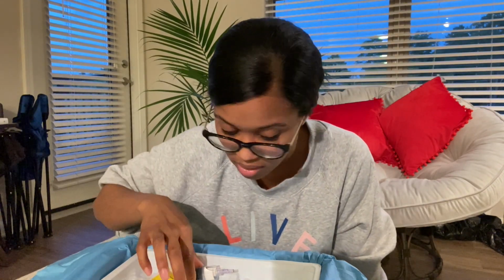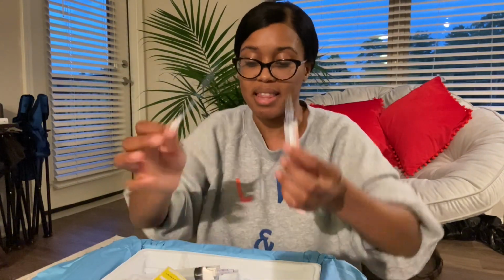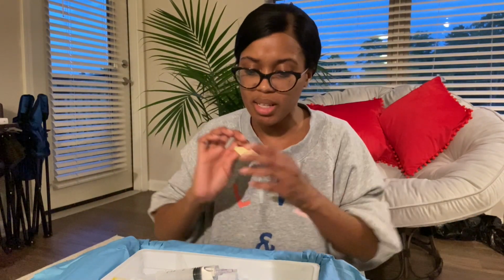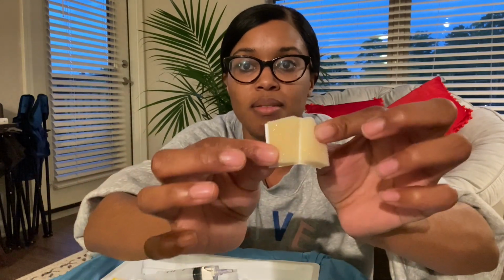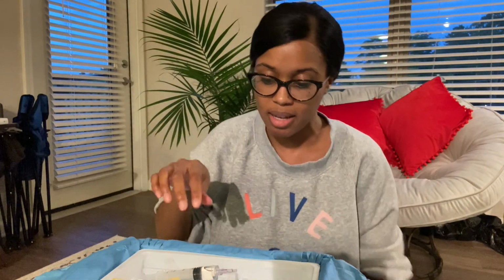And then what else? Oh, and then just a filter needle. And this is just to draw up our drugs. Since the vials that the different medications are in are glass, we just want to make sure no particles of glass get drawn up and into the syringe. So we have a filter needle, which helps prevent that. And what else? This little sponge helps once we're finished and taping up the patient's back and making sure the epidural doesn't move. It's a little sponge that can hold the end of the catheter, so it just stays on the patient's back.